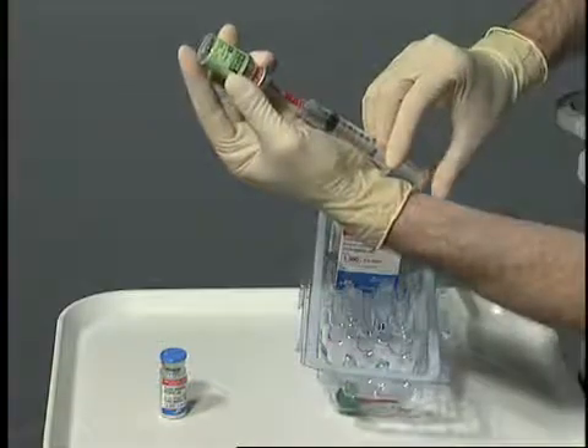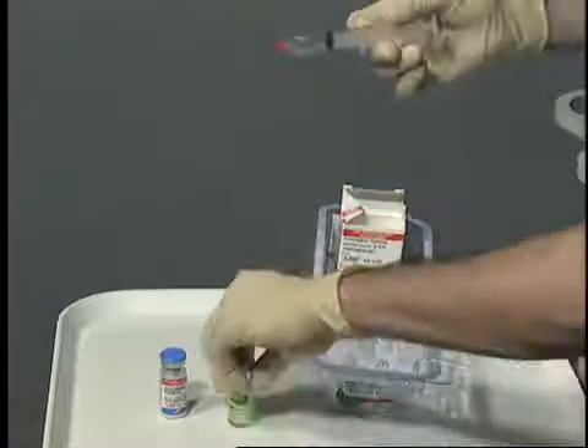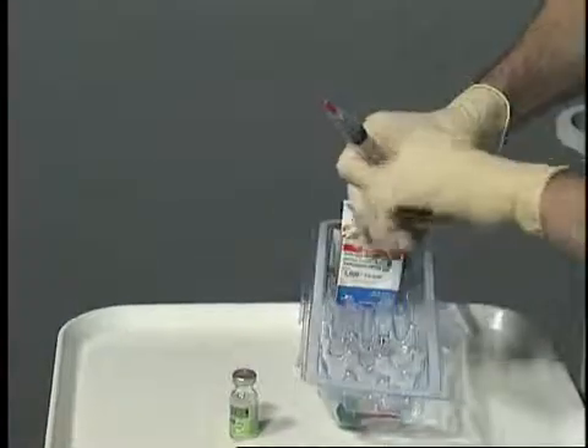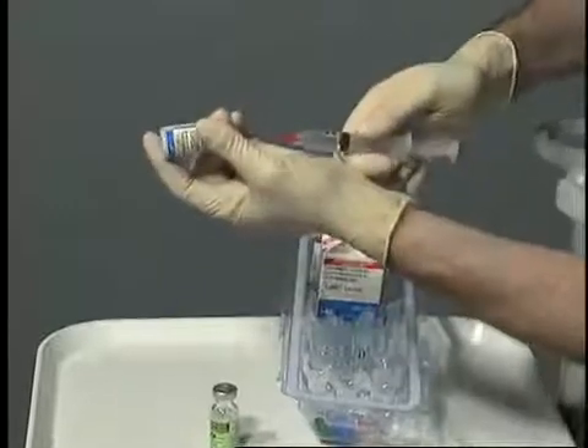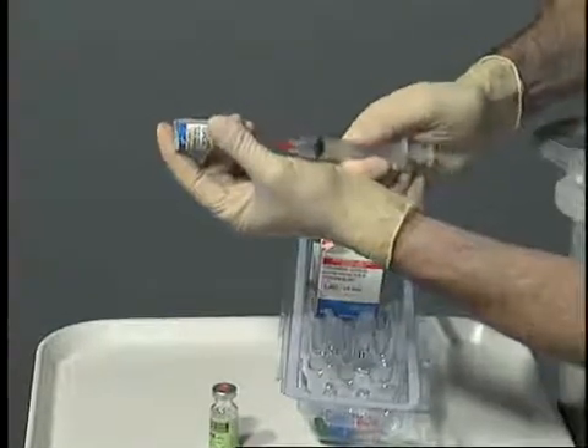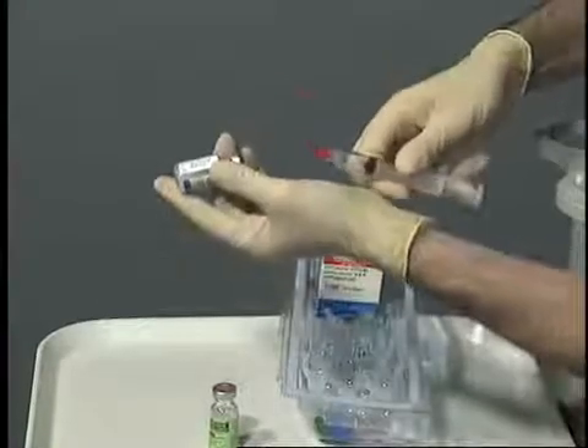Withdraw the appropriate amount of 10% calcium chloride into the extra syringe located in the process disposable kit. Inject the 10% calcium chloride into the vial containing the powdered thrombin. Invert the vial several times to ensure thorough mixing of the contents.